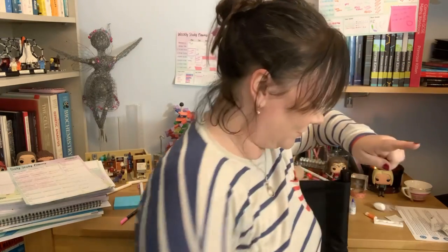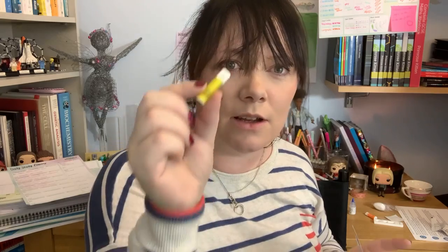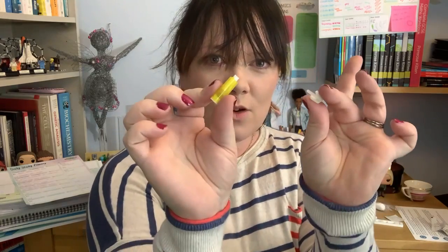Should I make flashcards? Yes, flashcards are a really, really good idea. So cleaned finger with alcohol wipe. Tidy dispose of things. Then I need to get the yellow little bit — they provide two of these, they call them lancets, so that if you don't get enough blood the first time around, you can have another go. But it says use the yellow one, so twist it. I've already wiped my finger, nice clean finger. Make a droplet of blood. Taking the lid off, I've got the lancet here, pop that over there and then stab myself.